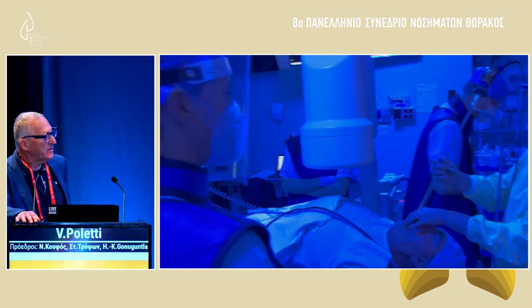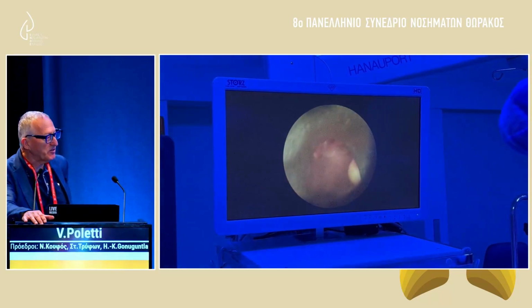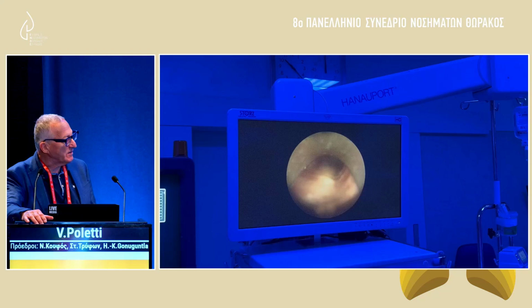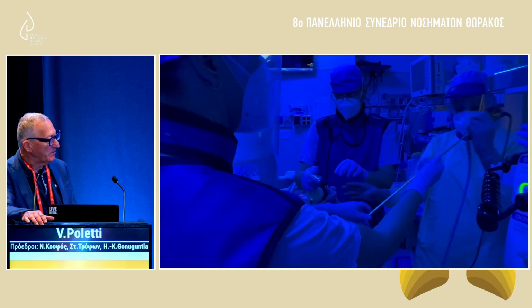Okay, thank you. We do it in that way, you see. We intubate the patient with a tracheoscope in order to ventilate both lungs without any problem. And because the tracheoscope is larger compared to the bronchoscope, we always insert the Fogarty balloon inside to control bleeding, major bleeding.